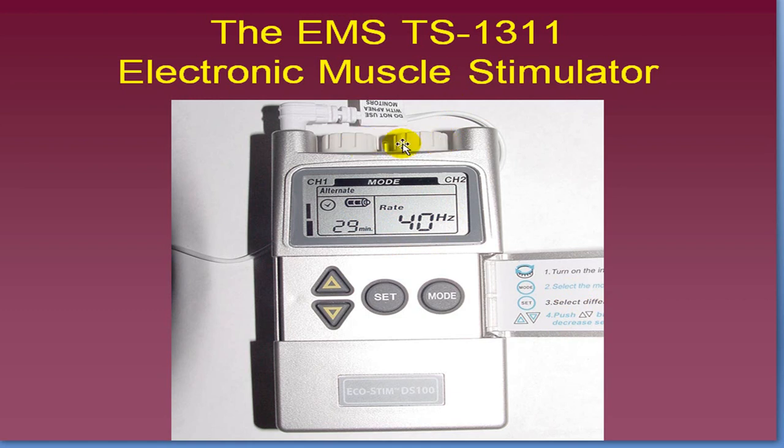You've got the dials up here on top. This would be the intensity dial for channel 1. This is the intensity dial for channel 2. And you've got these little bars that go up the side here. When these are moving, blip, blip, blip, that means you've actually got electric current going through the electrode, passing down through the electrode sites. So you've got your wire here that's going to lead to your electrode sites. When this black bar is going up and up, that means the electricity is actually flowing. When there's no activity and the bar is silent, that means that the unit is either off, or it's on rest mode, or it's between cycles. And we'll talk about cycles in a minute. But the main thing to know is to keep your eye on this black bar right here, because if this is going up, then you've got some sensation and some signal going out to your electrodes, and you'll all get to do this on each other.